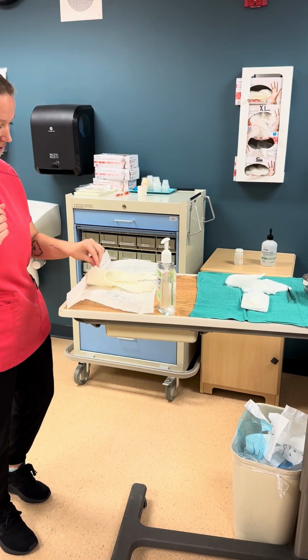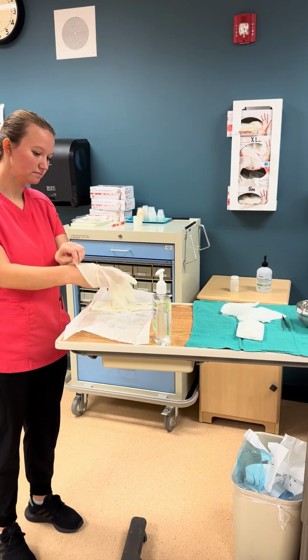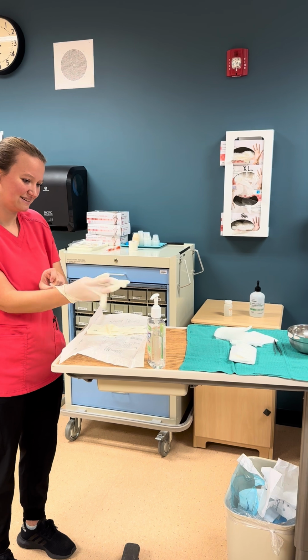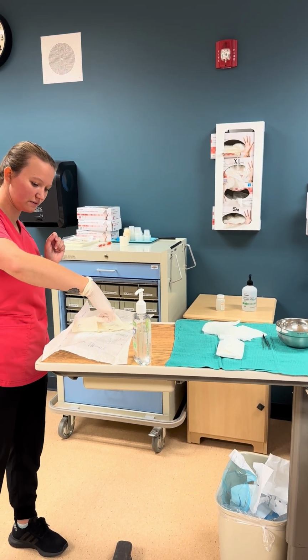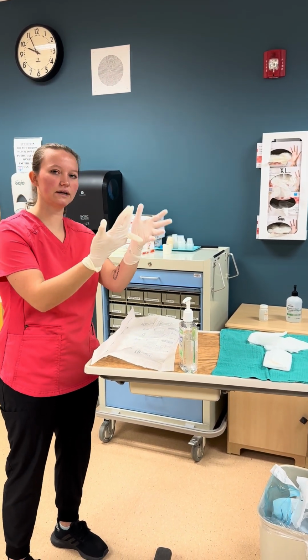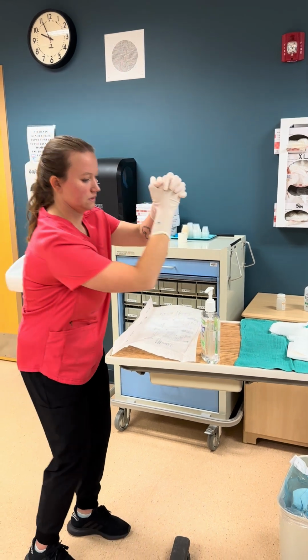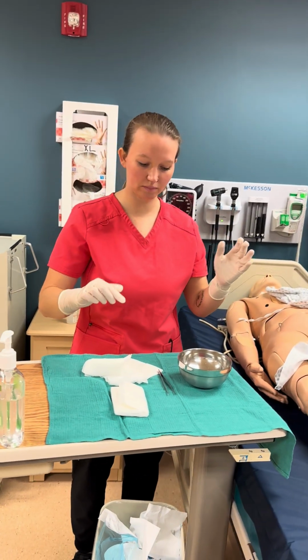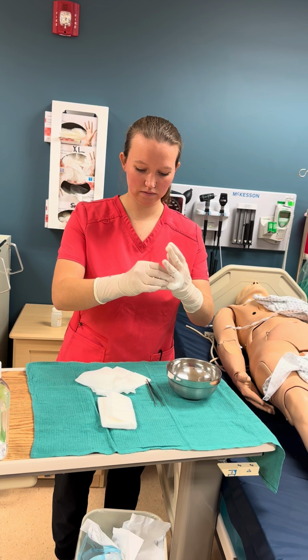Alright, I'm gonna take my non-dominant hand. Grab the cuff and throw them on somehow. Sure, worry about fixing that finger later. Then I can take my fingers, go underneath the cuff, and put this on. And then since sterile can touch sterile, I can adjust my finger here since we're kind of stuck. And then I can pull the cuff up. Okay. And then when I have my gloves on, I can start maneuvering my sterile field around how I need it. Above waist.